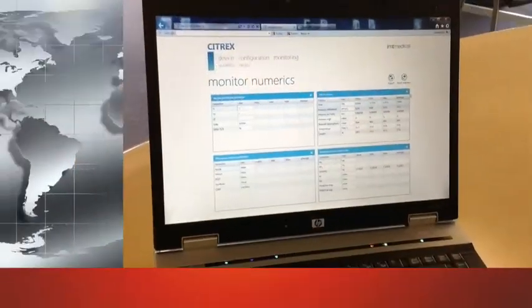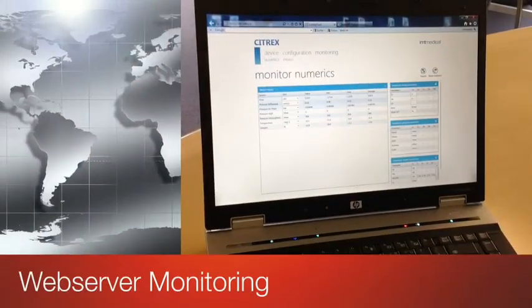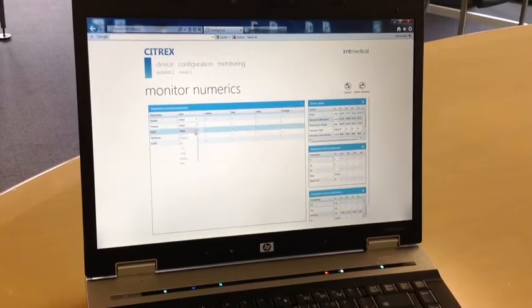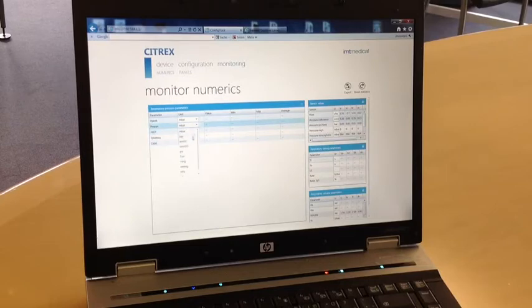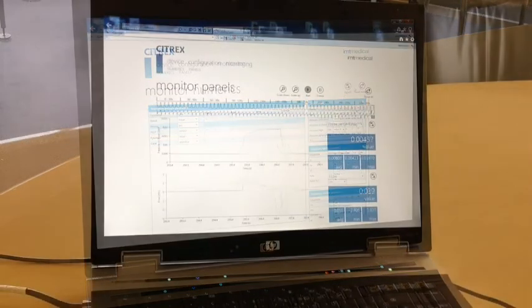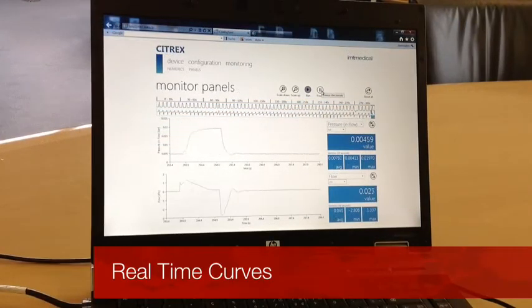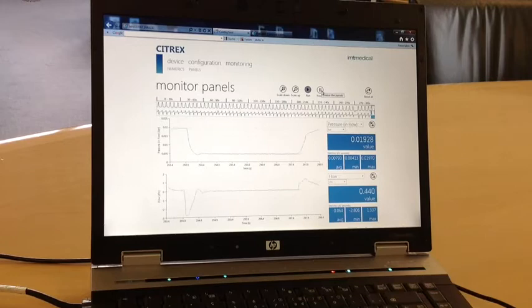The web server monitoring offers all respiratory parameters measured on your Citrex device in one view. Rearrange the four panels just via drag and drop. Real-time curves are easy and fast.